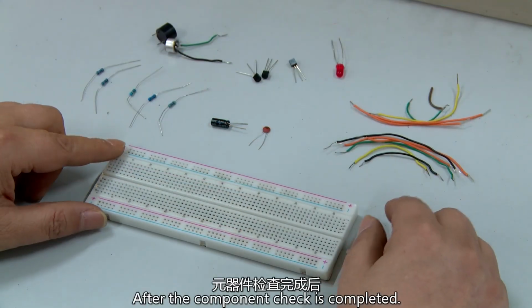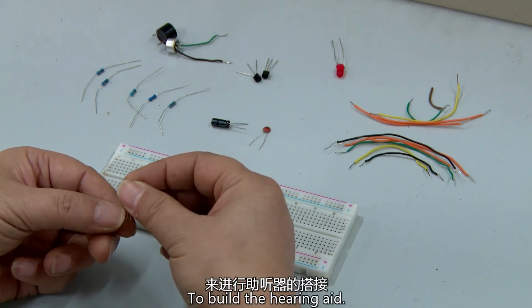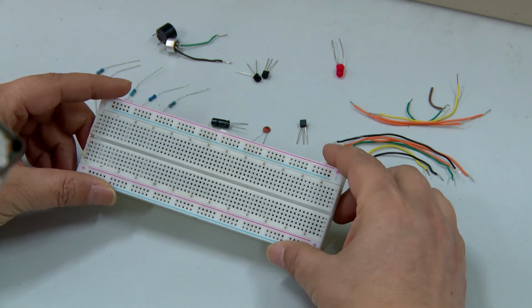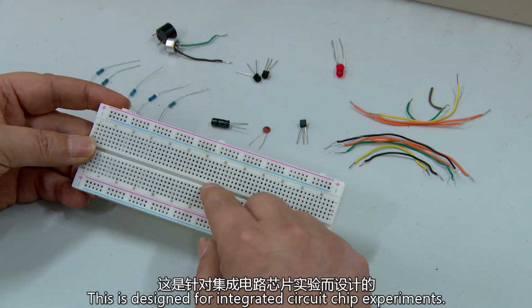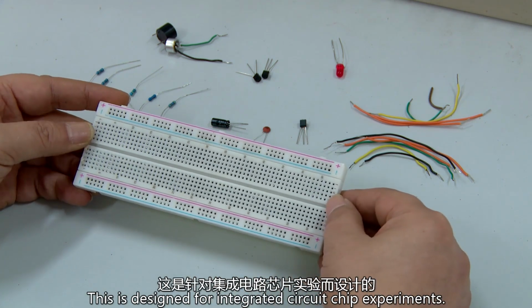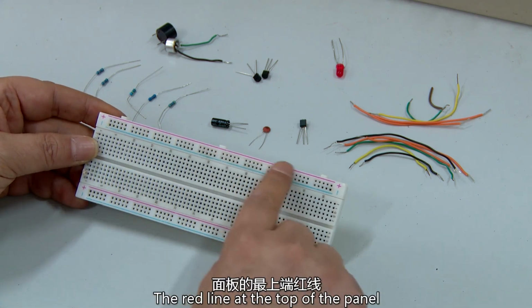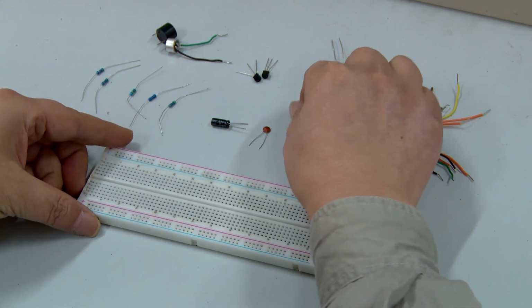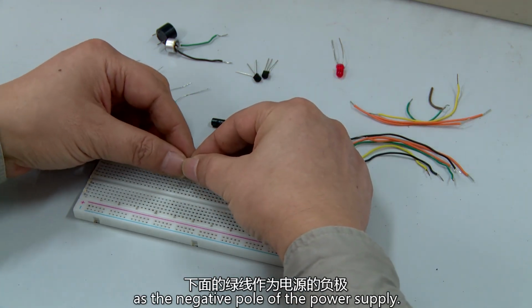After the component check is completed, now we build the hearing aid on the breadboard. This is a breadboard. There is a groove in the center of the board. This is designed for integrated circuit chip experiments. The red line at the top of the panel serves as the positive pole of the power supply. The green line below serves as the negative pole of the power supply.